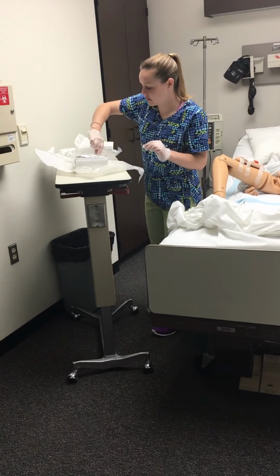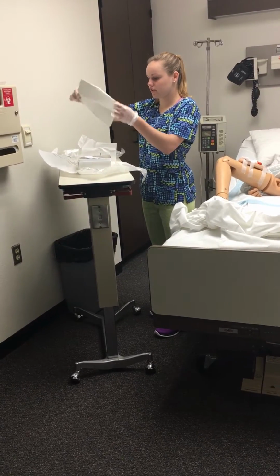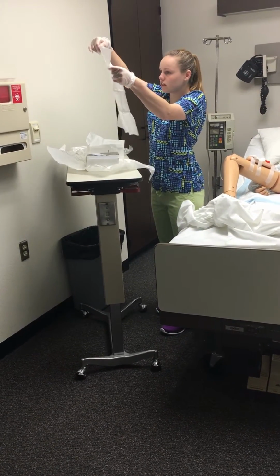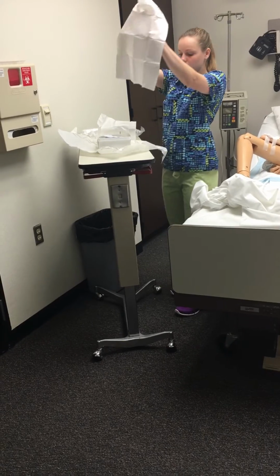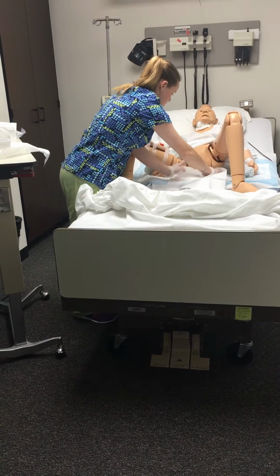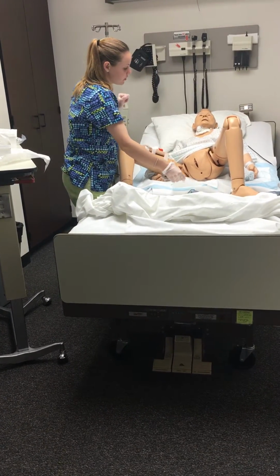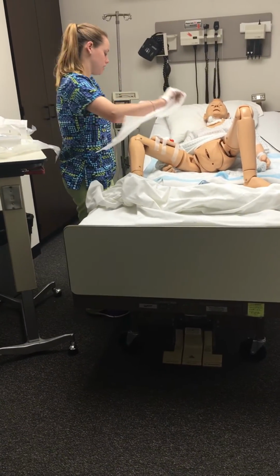Okay, and then we're gonna put this sheet down, shiny side first, and I can now touch this because my gloves are sterile. So let's just see if it pushes the shiny side. Okay. We're just going to turn it like this and put it right here under our patient. Okay. That actually was not shiny side down, so I would redo that part and I would insert it the other way.